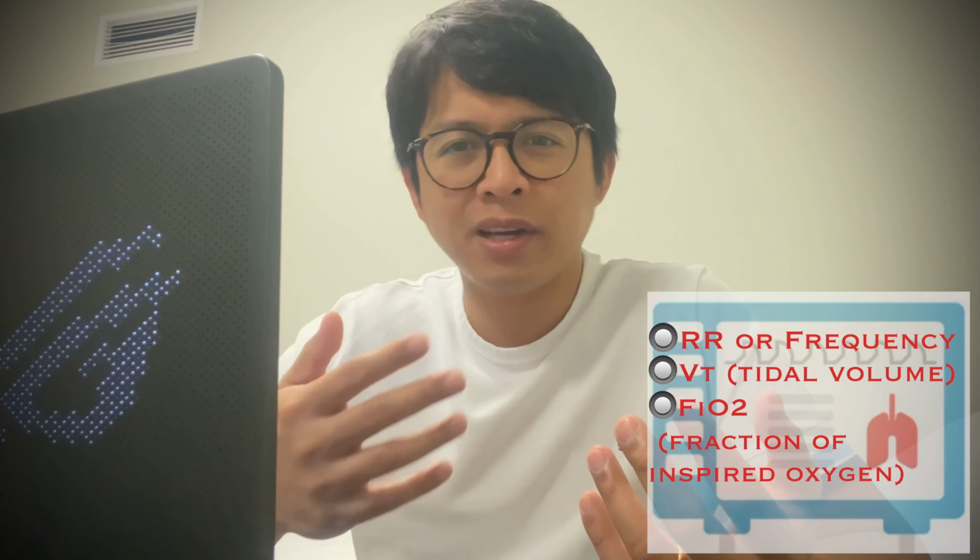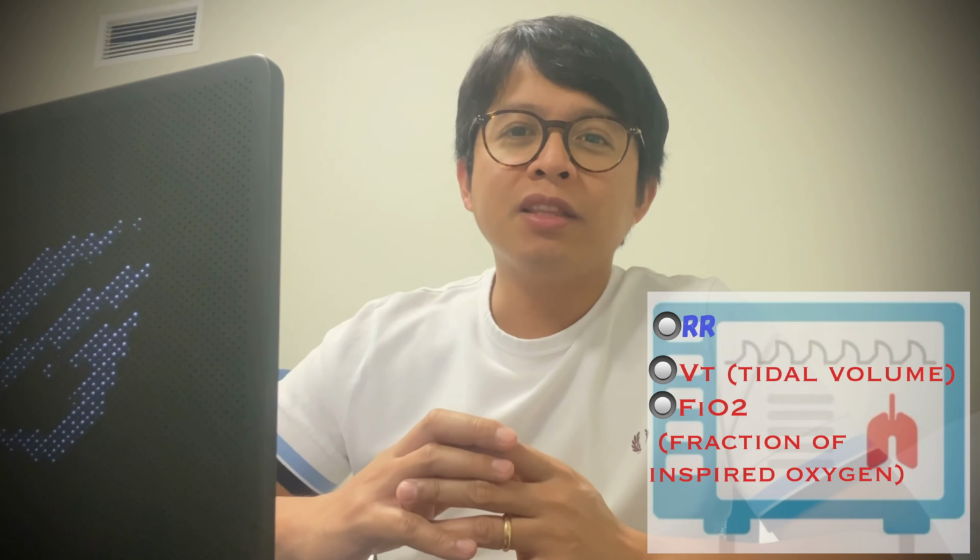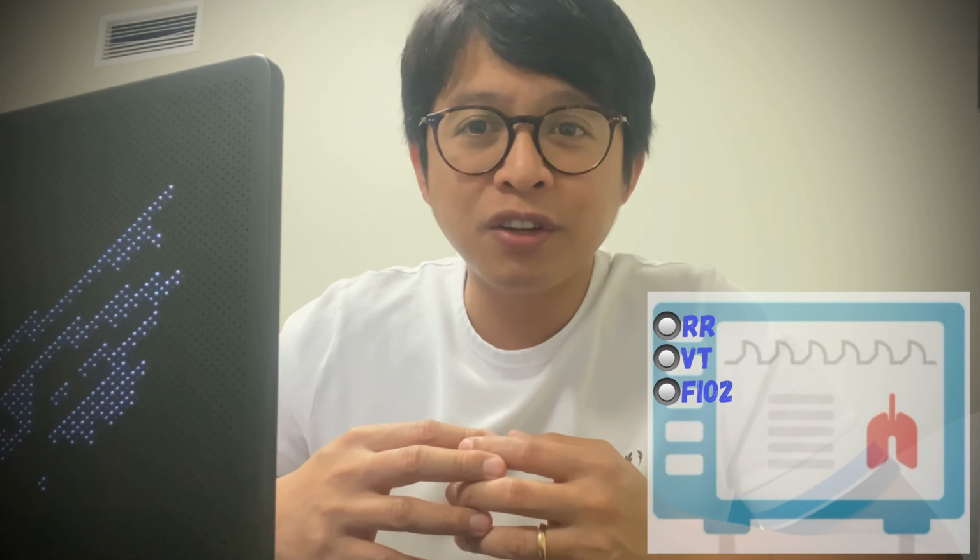So, when we talk about respiratory rate, it is the number of breaths in a minute. Tidal volume is the amount of air that moves in and out of the lungs with each respiratory cycle or breath. So that is one breath only. When we talk about FiO2, it is the concentration of oxygen in the gas mixture.